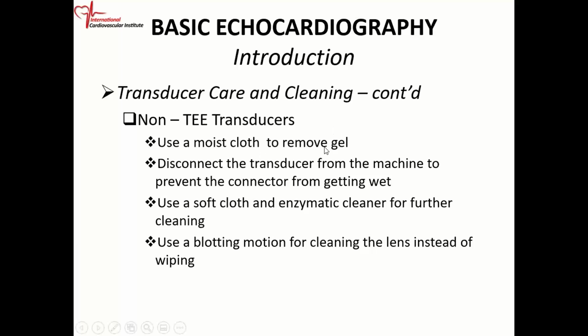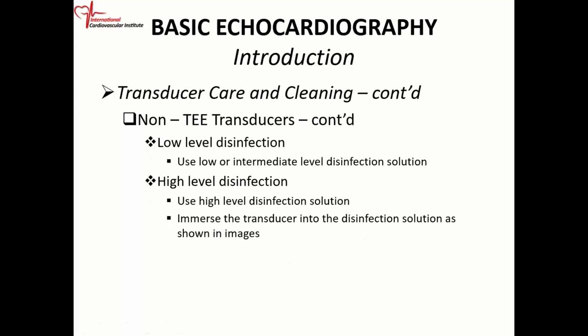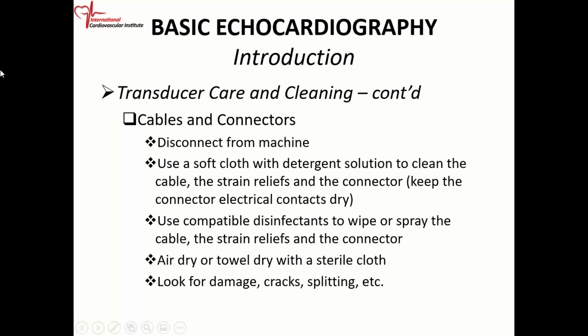You want to clean off the gel, because we use gel in all ultrasound techniques. You want to remove the gel, and then use the recommended cleaning solution to clean the probe. You don't want to use 70% rubbing alcohol, and you can do low-level disinfection or high-level disinfection. Just clean the probe, okay? When you're cleaning the probe, you disconnect it from the machine.